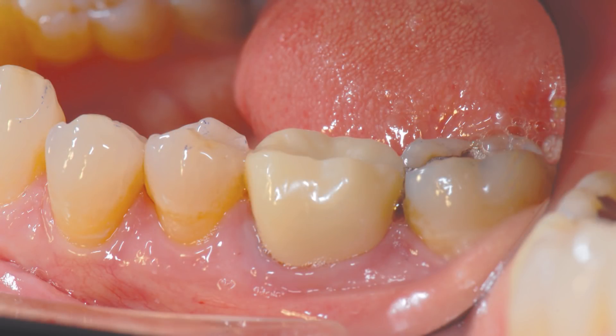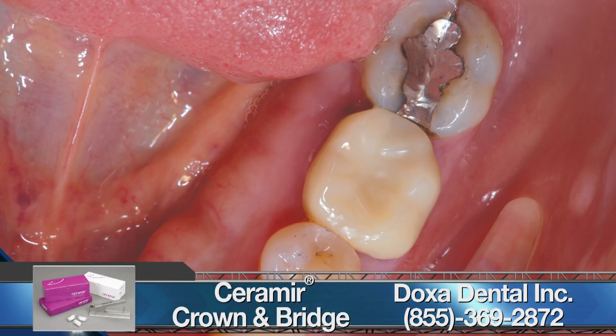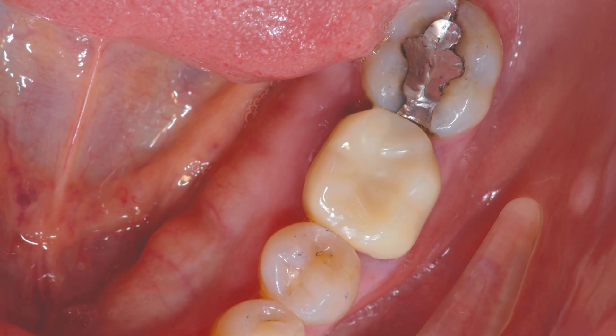The Bruxer Now crown was tried in, the contacts were perfect, and no occlusal or other chairside adjustments were necessary. The final outcome — the occlusal view of the final restoration — was delivered using Ceramir crown and bridge luting cement. The patient was extremely pleased with the well-fitting, high-quality final restoration, and especially the speed at which it was delivered.